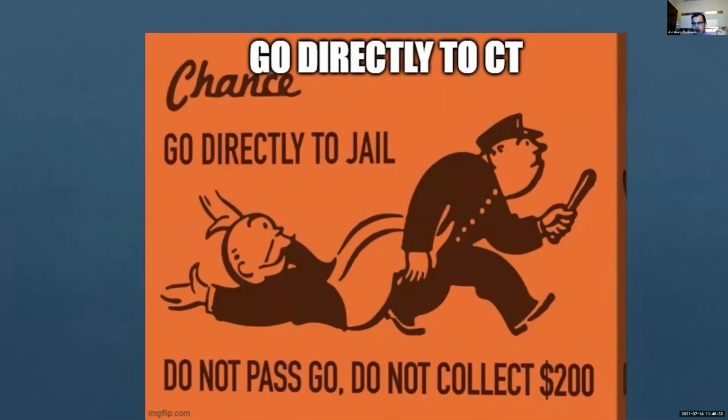Because again, what do we say? What's the mantra of stroke imaging? Time is brain. The longer we take to sit there and wait, the patient gets worse and worse and worse, and that's bad. So they're going to go straight to CT as quickly as we can, right?